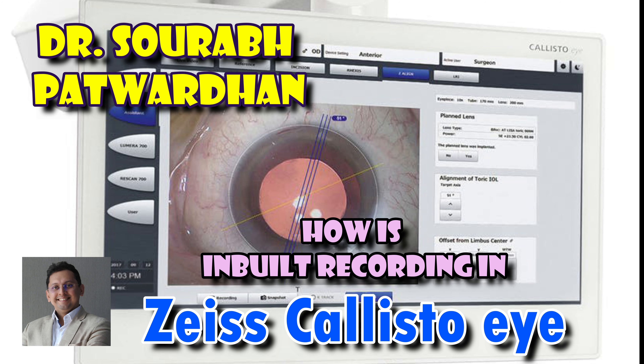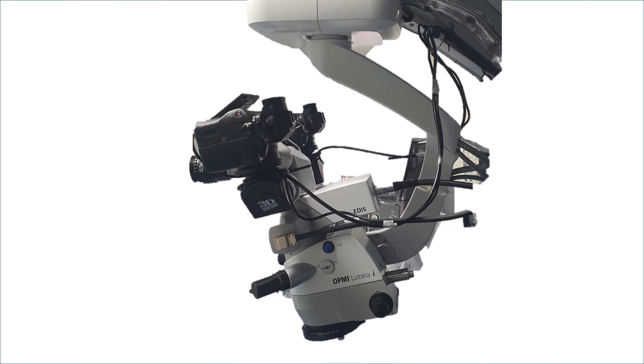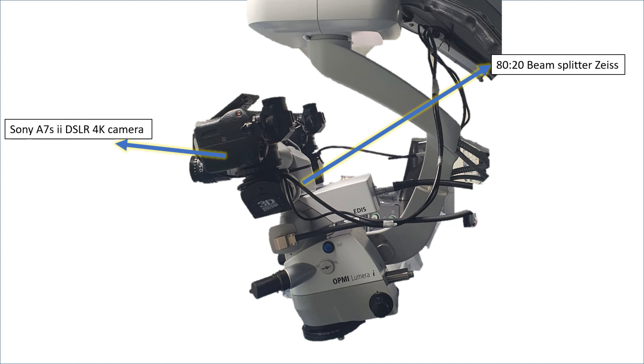When I decided to buy this markerless system, particularly for toric alignment, I was interested in the recording quality of this system. This is my microscope setup — it is a Lumeri microscope with AT20 beam splitter, and on this I have mounted a Sony A7S2 4K DSLR.